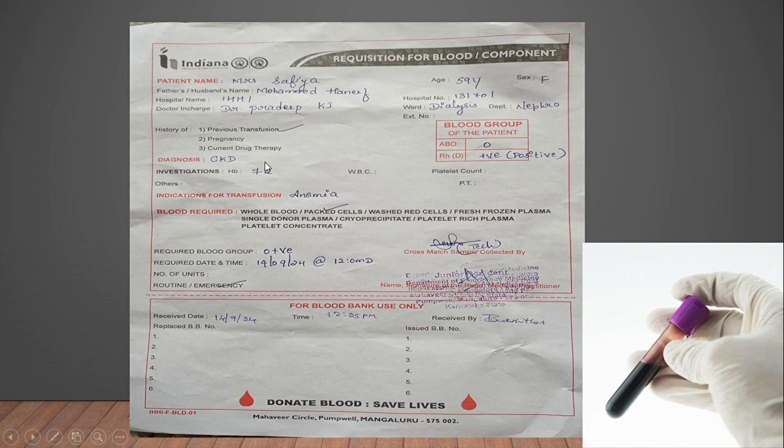Then subsequently they will send the blood requisition form with the patient name, UHID number, the blood group, why they are doing it, all these things. Along with that they send an EDTA sample also for us to cross match and all.